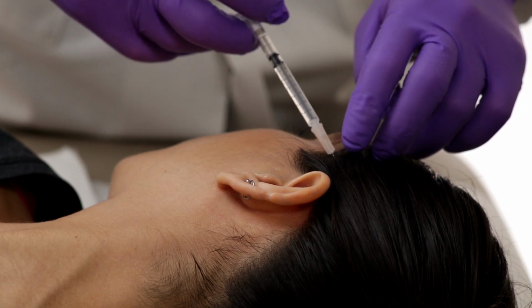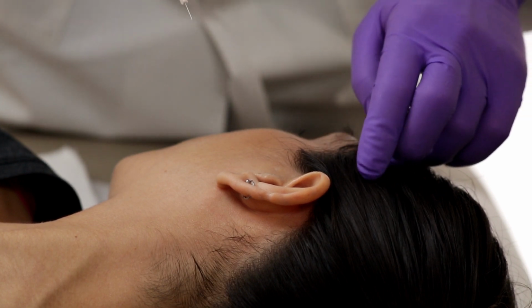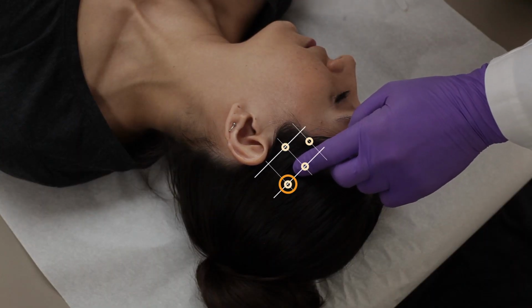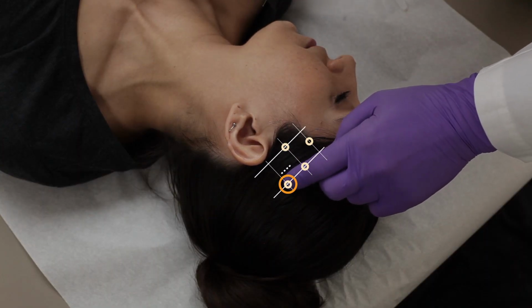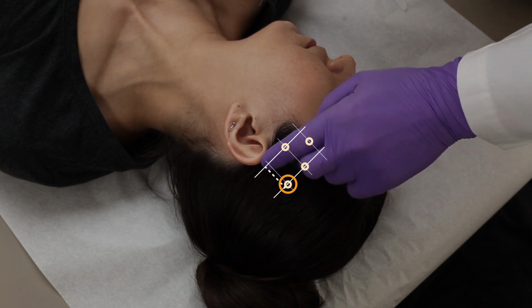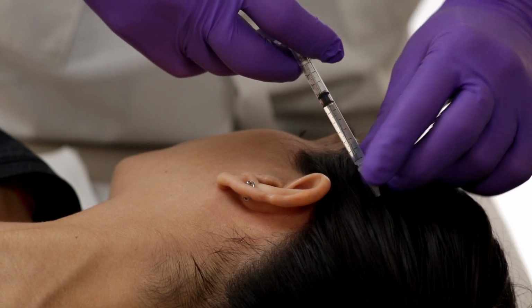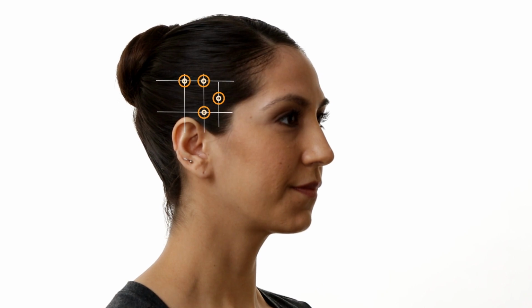This injection should still be within the hairline. For the fourth injection, move approximately 1.5 to 3 centimeters or 1 to 2 fingers breadth back from and in line with the second injection and in line with the mid portion of the ear. Make the injection. Repeat the 4 injections on the contralateral side.